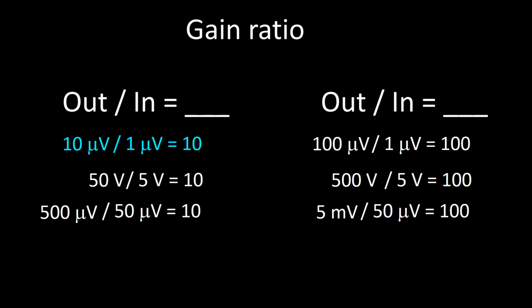Just as 500 microvolts out to 50 microvolts in corresponds to 10, and therefore they both can be described as having a gain of 20 dB.